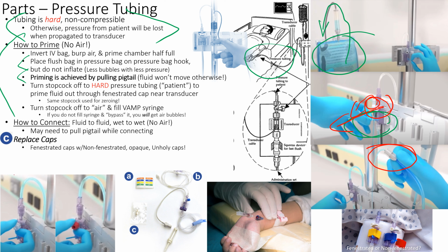But oftentimes you're going to find people that have not changed the hole on the side. And why is that an issue? On not changing the fenestrated caps to non-fenestrated. Yeah, infections can get into that little hole, right? So we want to make sure that we're changing all these little fenestrated caps, which are gray in color, to a non-fenestrated one that is dead-ended, right?